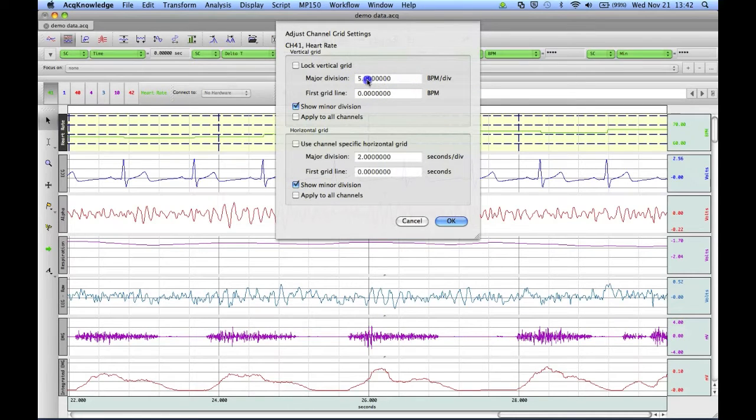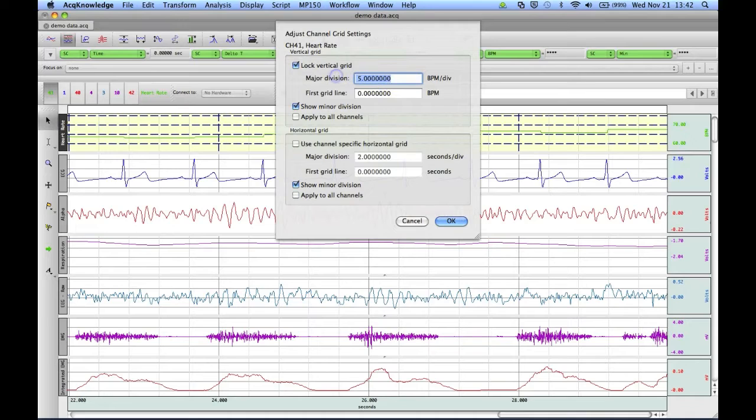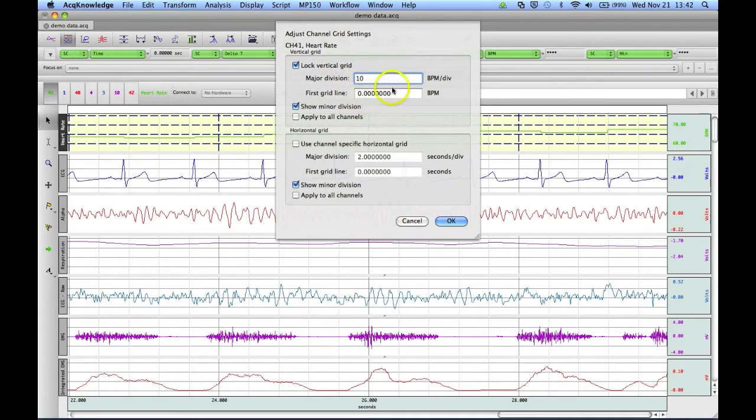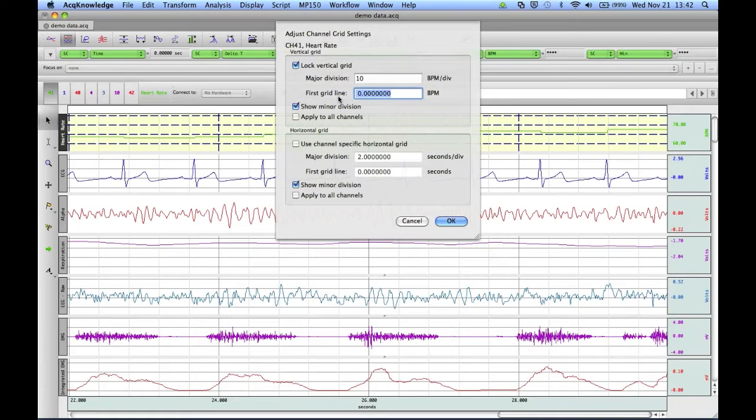we can change this to 10 by locking the grid and entering 10. We can choose our first grid line to appear at 60 beats per minute.